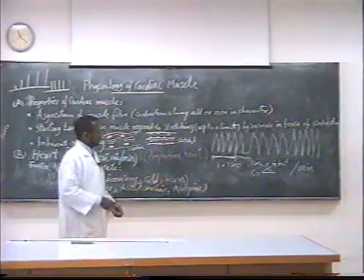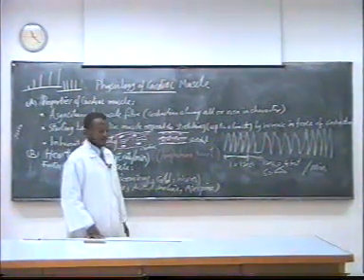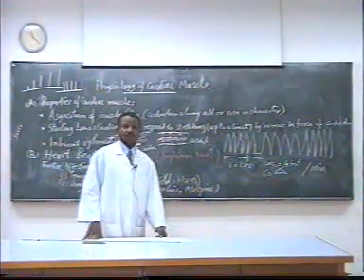So we're going to start the demonstration by dissection to expose the heart of the frog, and after that we fix the heart to the myograph and we record using the physiograph.